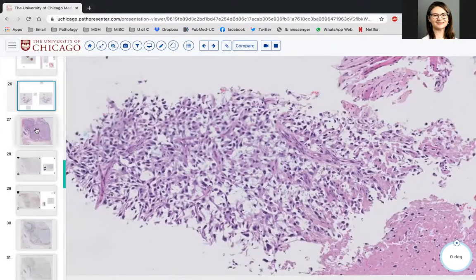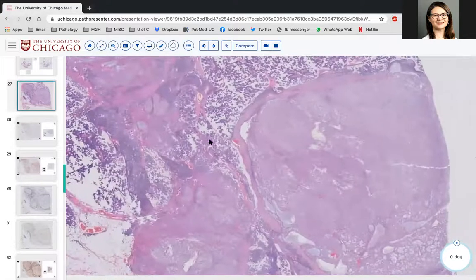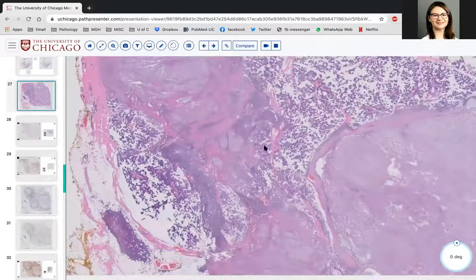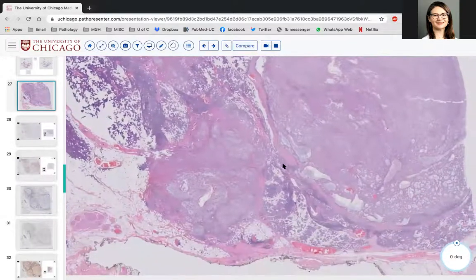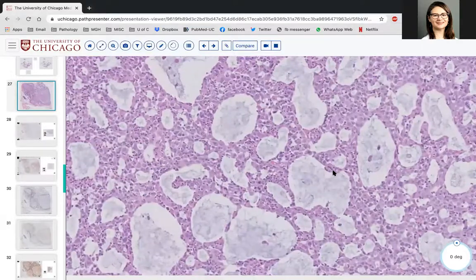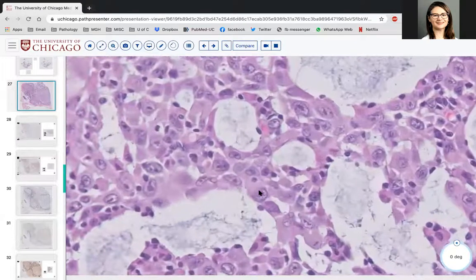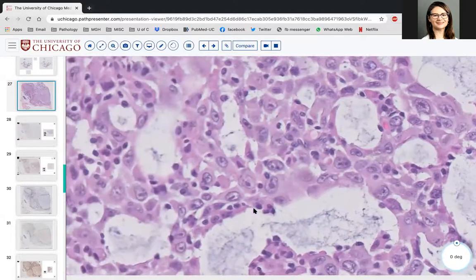So high-grade carcinoma, they're going to resect, and assuming that the patient doesn't have any other carcinomas elsewhere or melanomas elsewhere, they'll probably treat this as if it were a primary and probably do a resection and a neck dissection. And so here is indeed the resection specimen showing these multiple lobules, which are compatible with sort of infiltration of pre-existing parotid. And plasmacytoid appearance. Yeah, I think some of the cells had a plasmacytoid appearance with sort of eccentrically located nuclei.